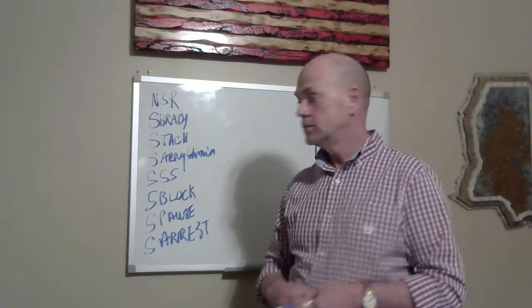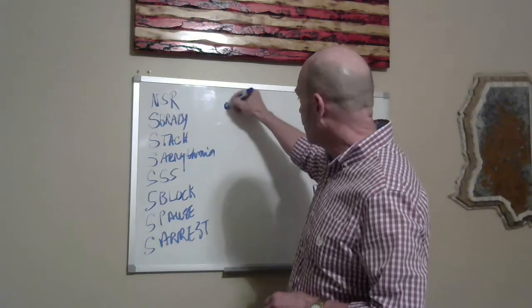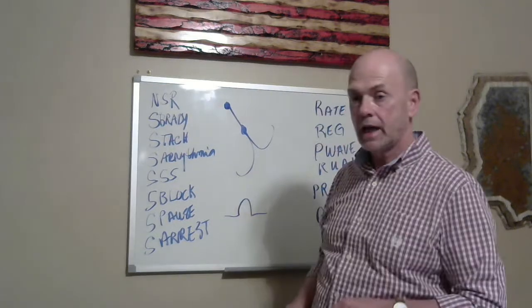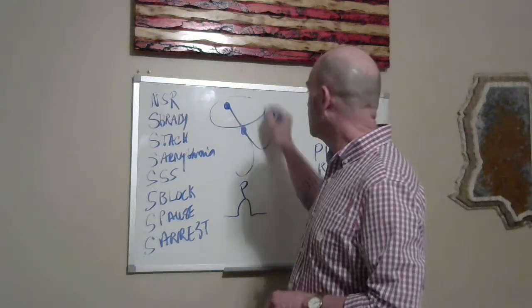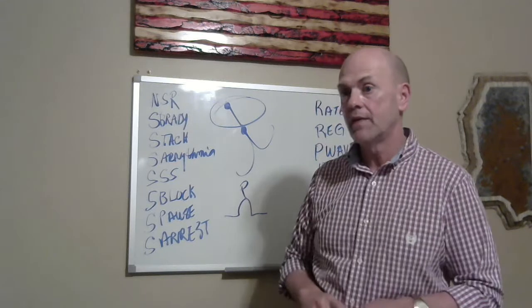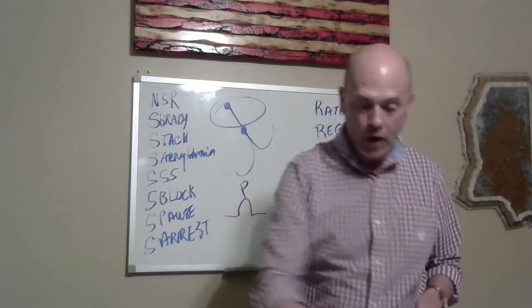There are no more. One thing we know about all of these rhythms, that atrial depolarization that is shown on the EKG tracing in the form of a P wave, because the atria up here contracted in syncytium and generated that positive deflection in the beginning of the EKG tracing. All these P waves are going to look alike.